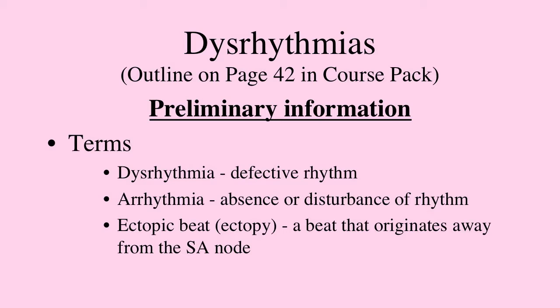A lot of times, again, dysrhythmias, similar to the AV blocks, will be diagnosed based on a rhythm strip. So that makes it a little easier just to look at rhythm strips. You can see these on 12 leads, but usually rhythm strips are used. We'll primarily be using the course pack, and the outline in the course pack is on page 42.